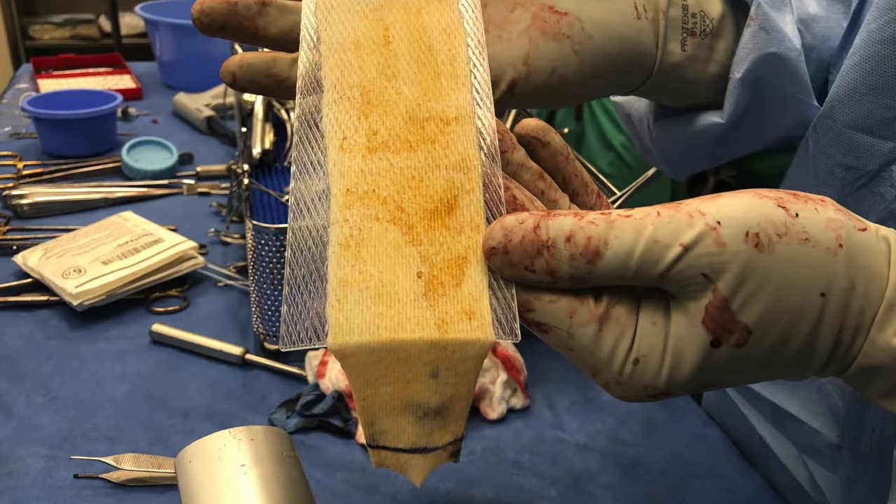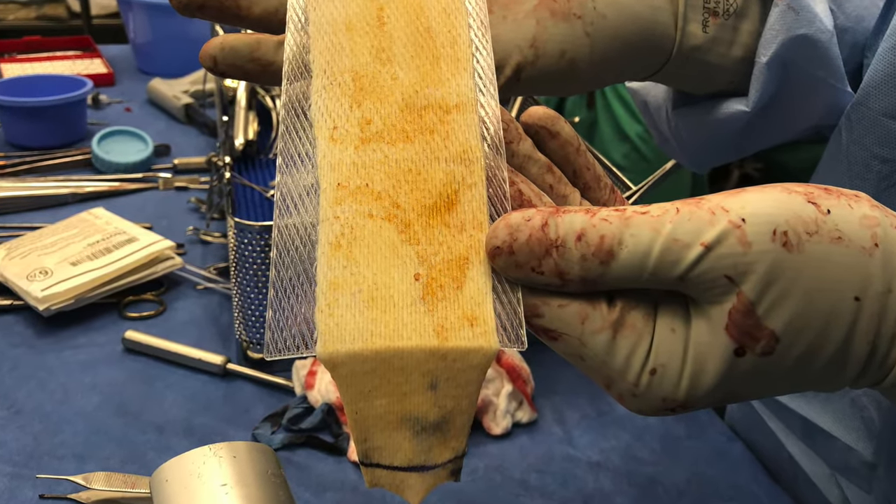Here is what the skin graft should look like just after running through the mesher and just before it is going to be applied.